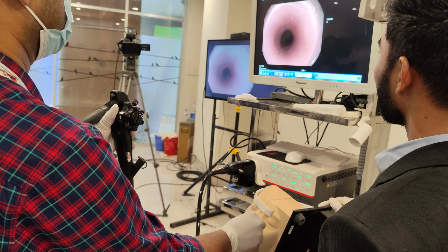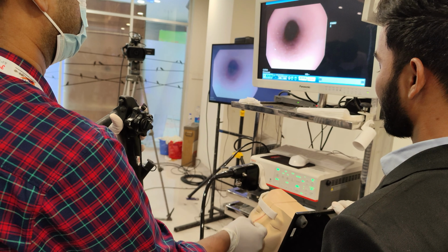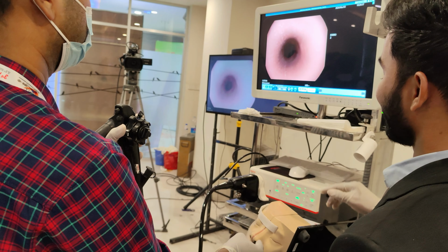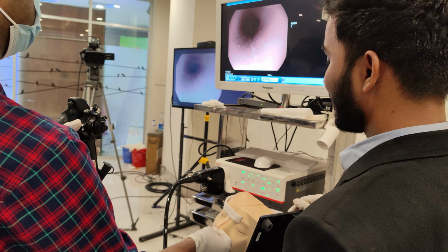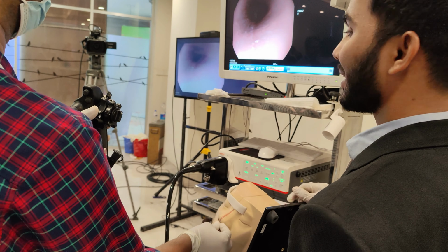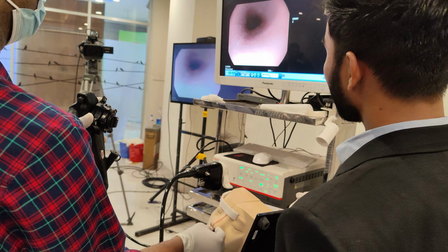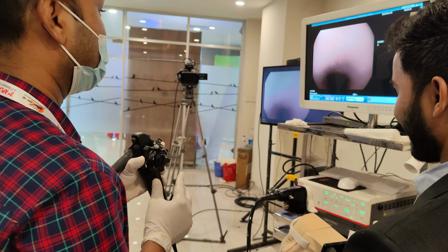We have to advance it through the gastroesophageal junction into the stomach. If the scope is of appropriate size and with good function, then it should be retroflexed to observe the esophageal hiatus from below, which was not possible in this case. So return the esophagoscope to normal position and evaluate the mucosa on exit.